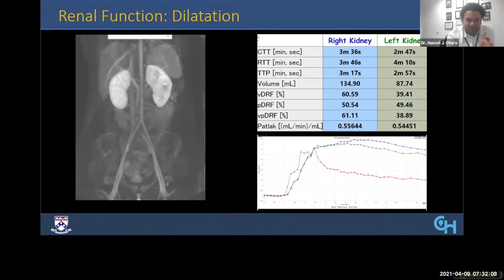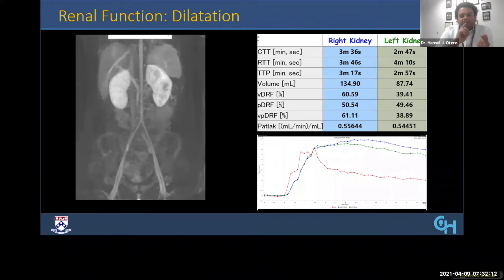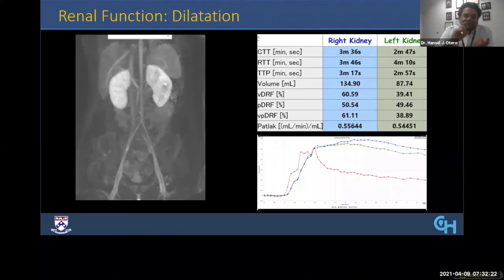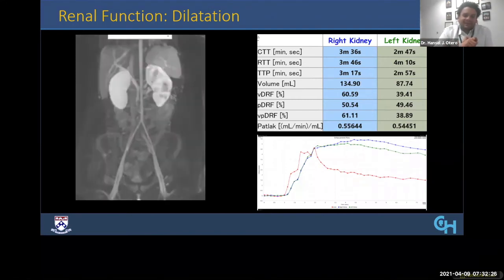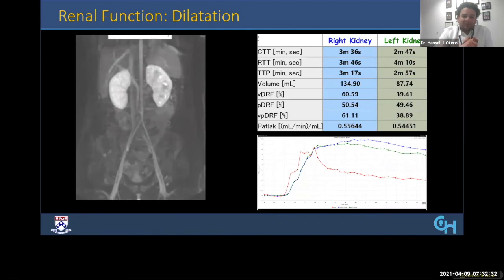That's the main differentiation. Okay, so now we review how to do ultrasound, the indication, the timing, and the proper technique. We review VCUG. We review the opportunity of doing contrast enhanced ultrasound to substitute VCUG.